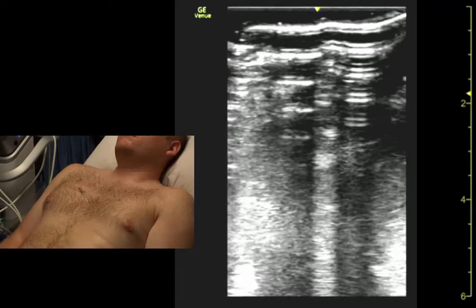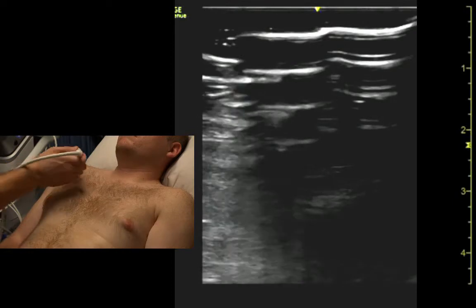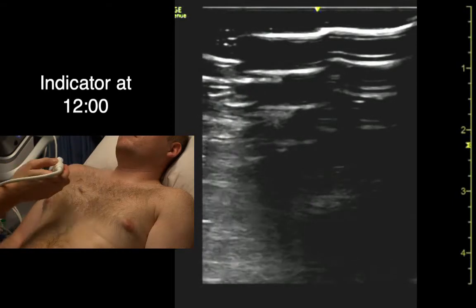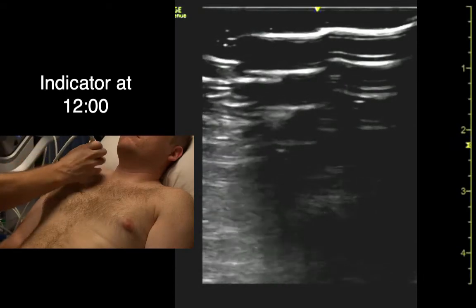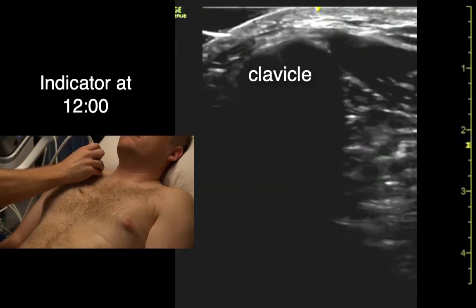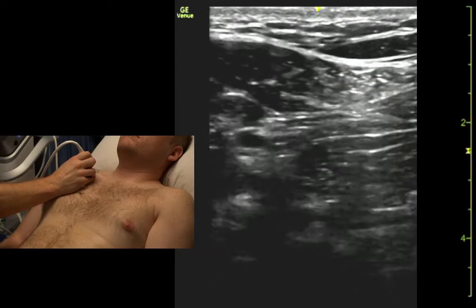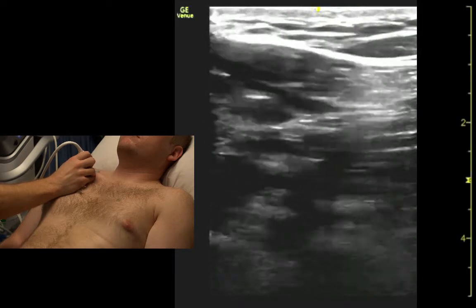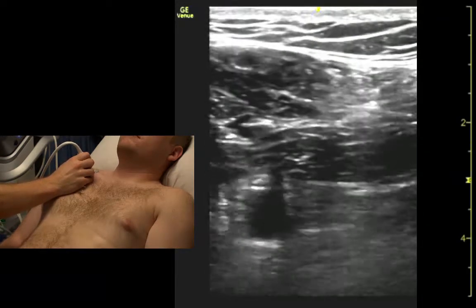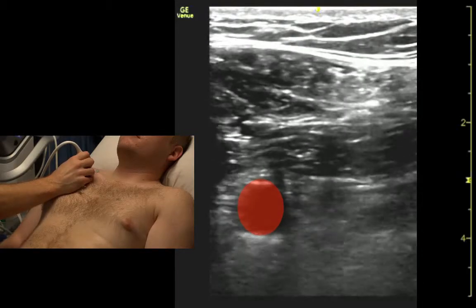I'm going to come out of the chest mode for a minute to look at subclavian vessels. So if we're looking for upper extremity DVT, we would do this. We come up with the linear probe, right up on the clavicle, right on the middle, find the clavicle, slide just below the clavicle, and then we can see the subclavian artery pulsing down here.